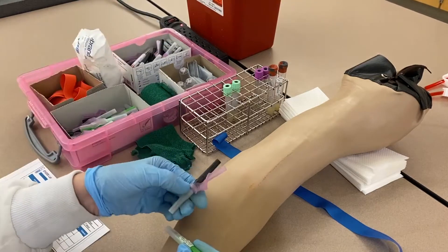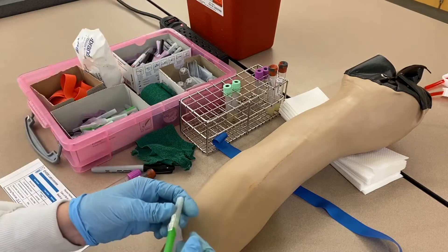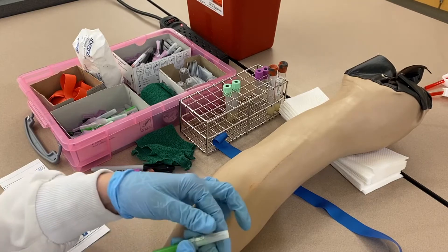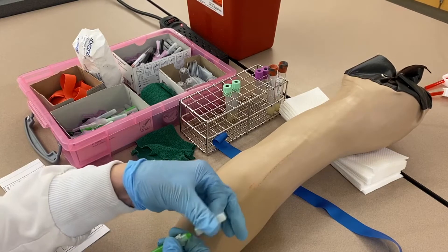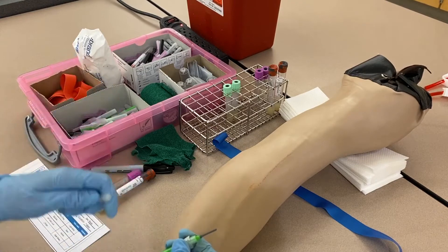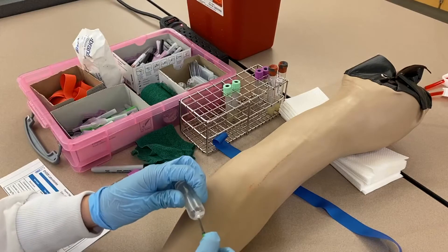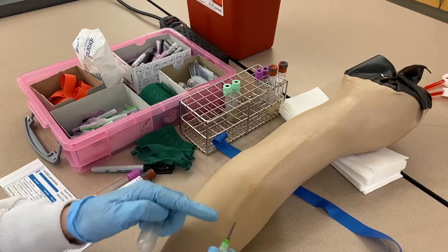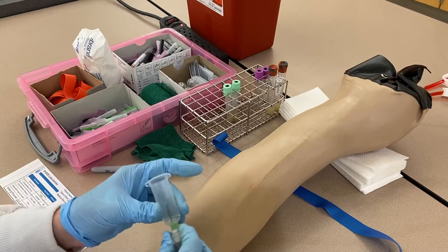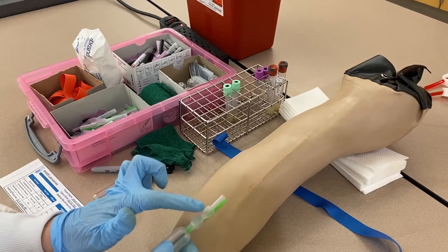We also have 22 gauge needles, which are slightly smaller — a good option for patients with smaller veins. To assemble, hold the green part with your middle finger and thumb, then gently twist off the white part. If you don't hold the green part, it can pop off and you'll have to throw away the entire apparatus. Take the tube holder, twist it in — inside the gray part is a needle that actually punctures the top of the tube. Finger tighten it; it doesn't have to be super tight.